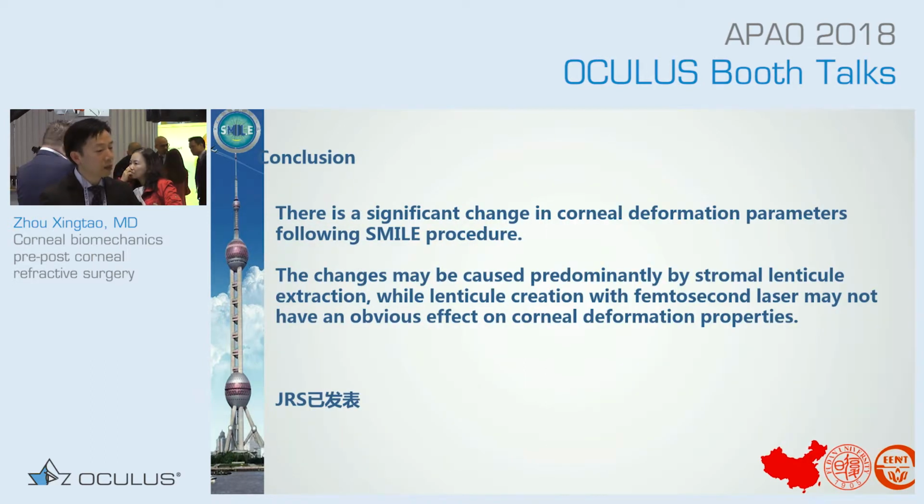So the conclusion is there is a significant change in the corneal deformation parameters following a SMILE procedure. The change may be caused predominantly by stromal lenticule extraction, while lenticule creation with the femtosecond laser may not have an obvious effect on those properties.